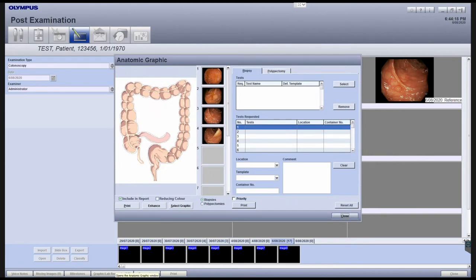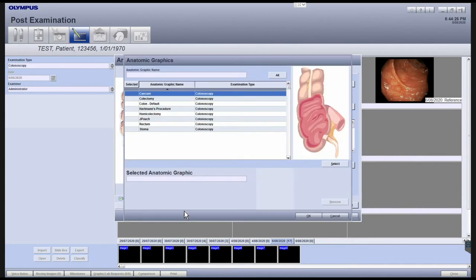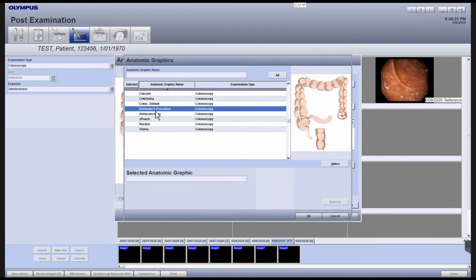The default graphic is selected based on the procedure type. To view other graphic options for this particular procedure type, click the Select Graphic button. Here you'll be able to see other available graphics for this particular procedure type.